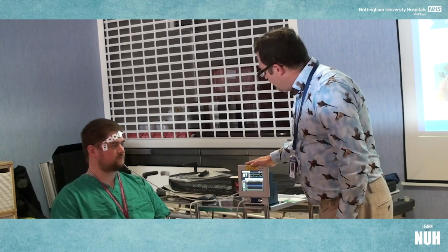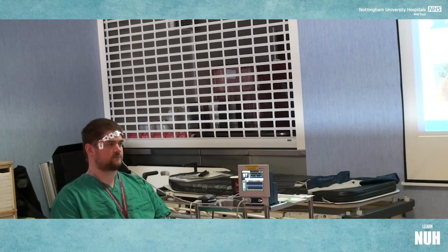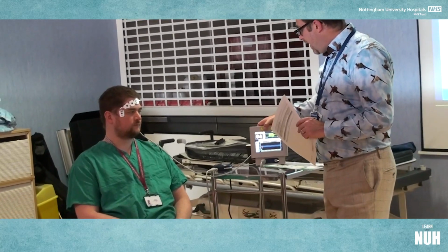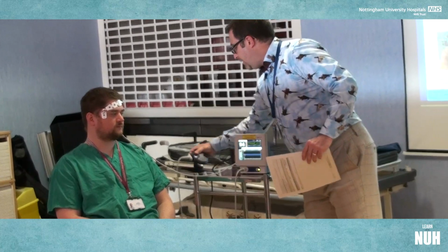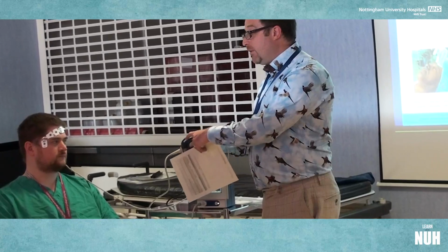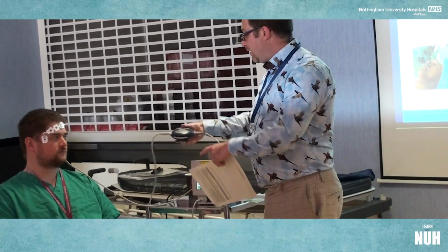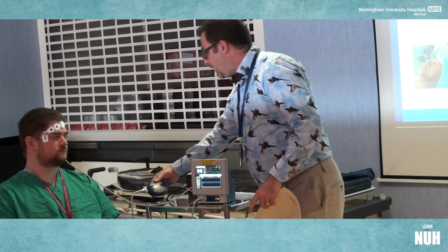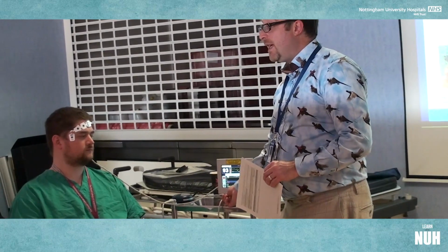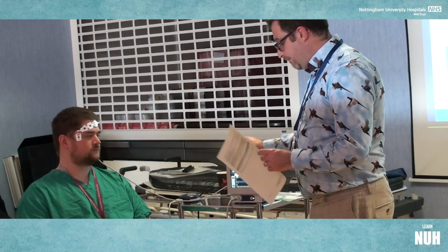Okay. So a bit of an experiment there to show you around the monitor. So what I'm going to do is just run over the main features of the monitor with you. So always check for damage, wear and tear. Obviously in the housing here, in the BIS-X, which is this section here, this is where all the computation occurs. So we're looking for damaged seals and that kind of thing, damaged clips on the back. Get that down to medical physics if you notice that. And obviously if anybody's pulled this or this doesn't connect properly.